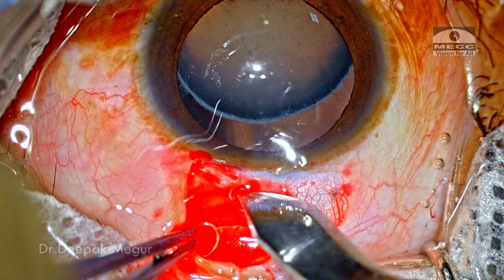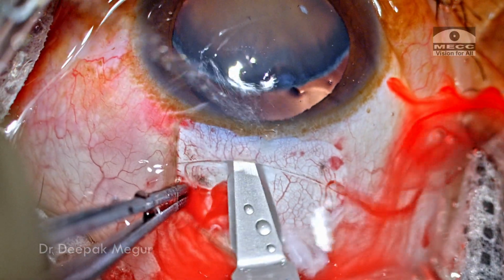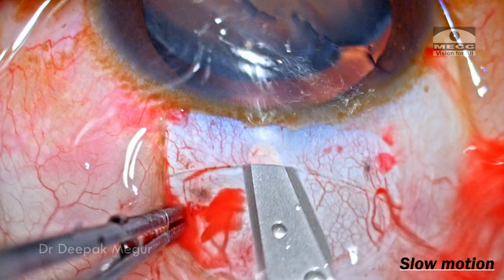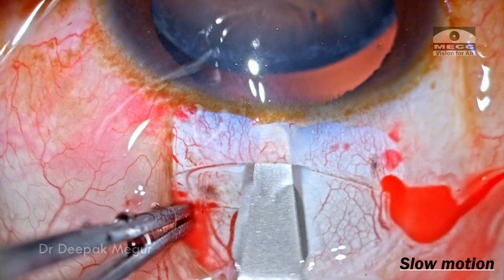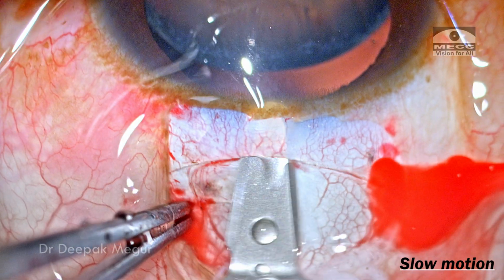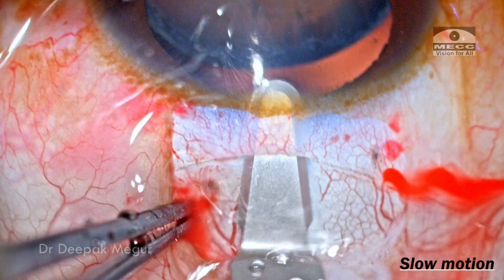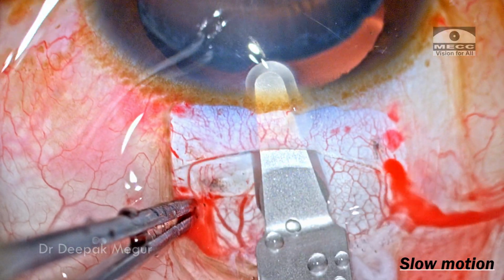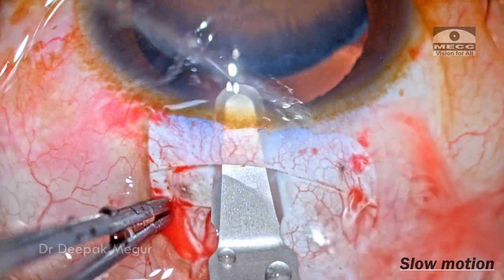A 6 mm partial thickness scleral groove is created, and then the tunneling is started using the crescent blade. I prefer to begin the sclerocorneal tunnel at the center. One evidence that the blade is in the right plane is to see that the blade is just visible through the sclera as the tunneling is being done. This is an indirect hint that the blade is in the right plane, not too deep, not too superficial.